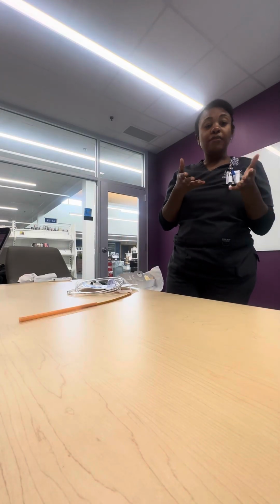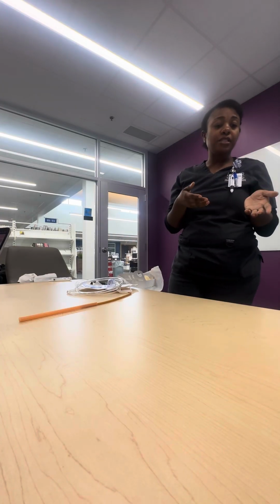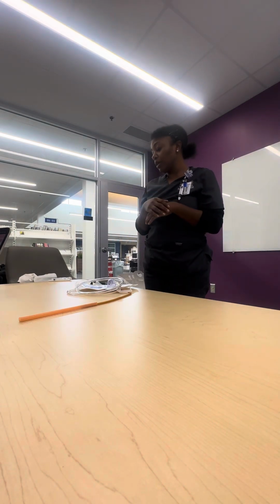I'm going to introduce myself, let them know I'm Keosha. I'm the student nurse here to remove their Foley catheter. I'm gonna ask them about their allergies. I'm gonna ask them if they're experiencing any pain. And then I'm gonna also wash my hands and put my gloves on.